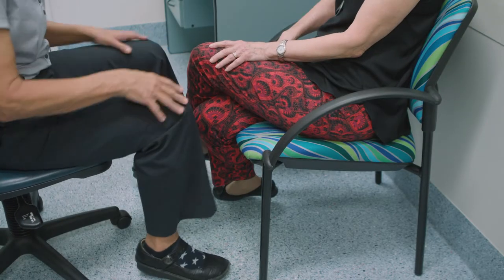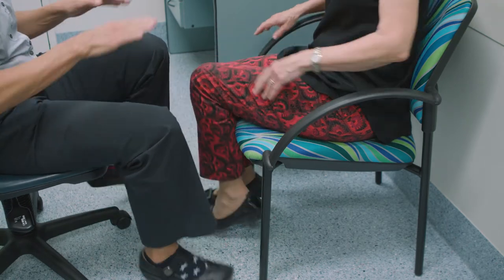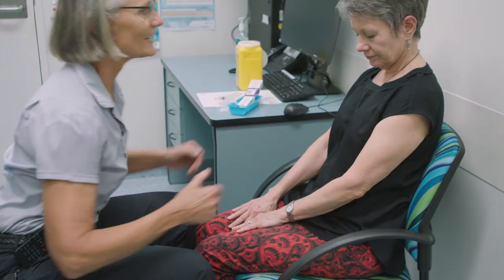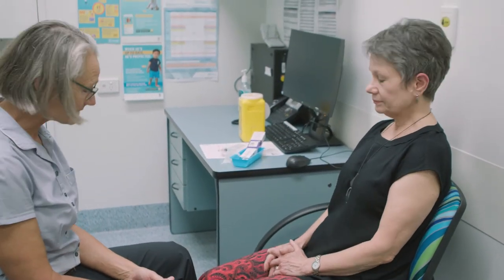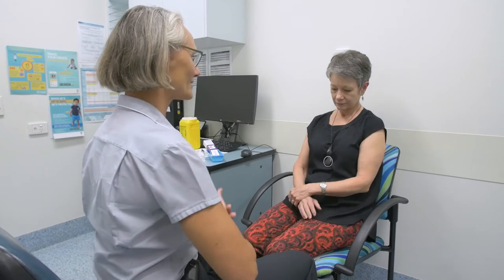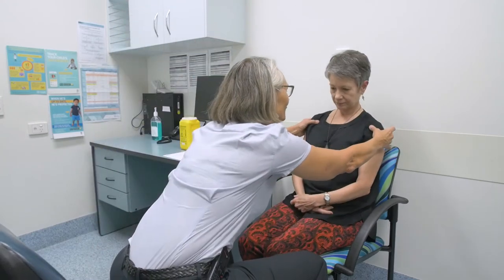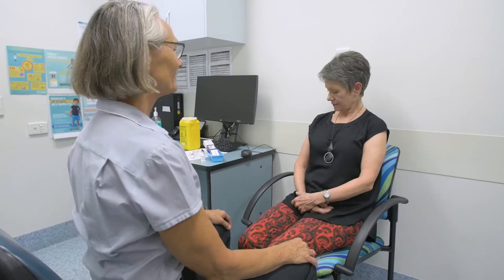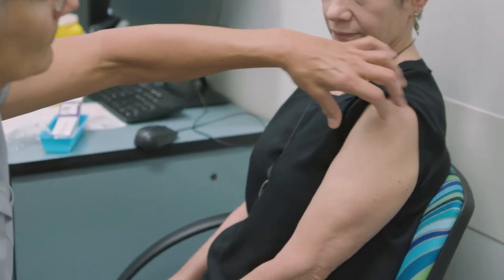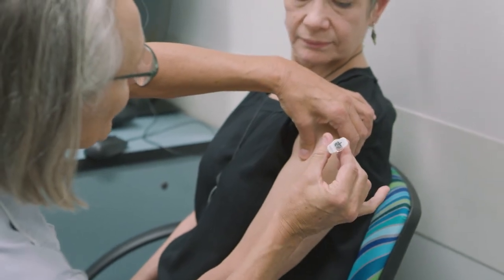Adults and older children should sit in a straight-back chair, feet resting flat on the floor with forearms and hands in a relaxed position on the upper thighs. Ask them to keep the arms flexed at the elbow to encourage the deltoid muscle to relax. Encourage their shoulders to drop by asking the person to raise their shoulders up while taking a deep breath in and to drop them while breathing out fairly forcefully. Hold the needle like a dart and with a quick thrust, insert the needle at a 90 degree angle to the skin.